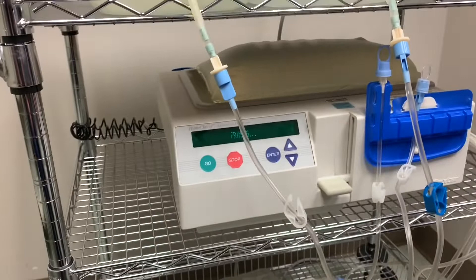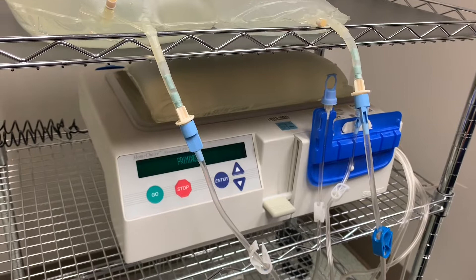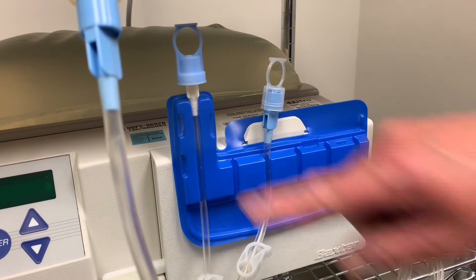Press Go — the machine is now priming. You don't need to sit here and babysit it while it's priming; you can come back in about seven to eight minutes. When you return, it will flash between 'connect patient' and 'check patient line.' Check patient line means you need to verify that the fluid went all the way up to the patient line, which will be shown again when we demonstrate how to connect the patient.